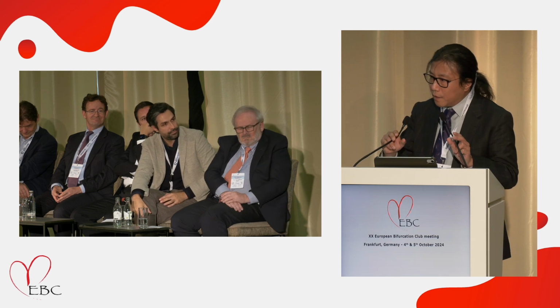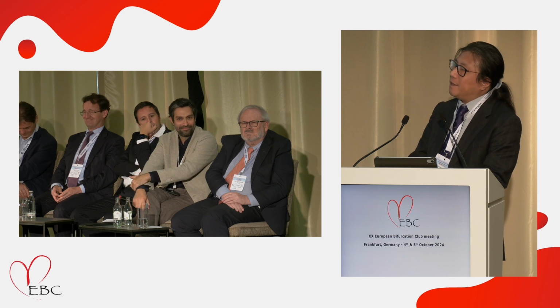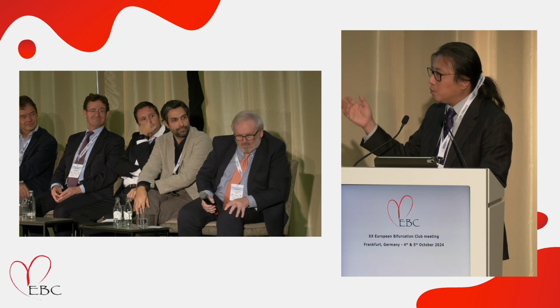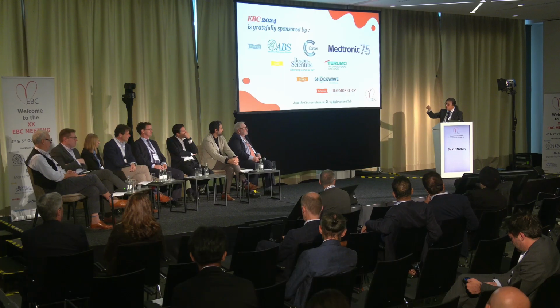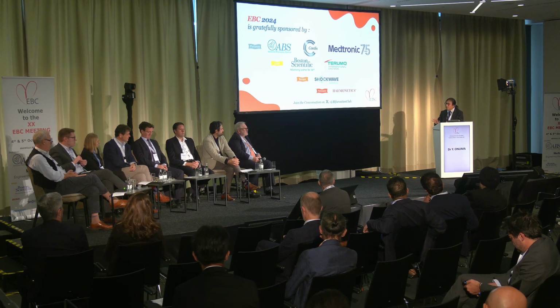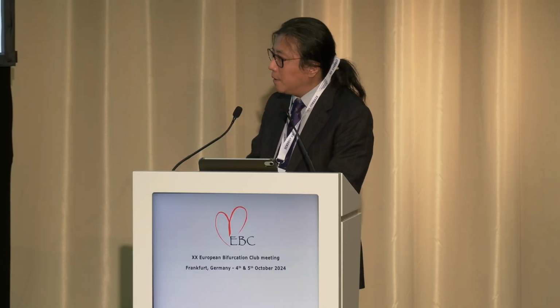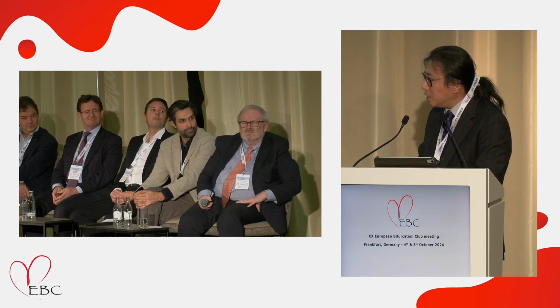Yeah, thank you for your comment, and I agree that we are also a little bit shocked to see this result. But one thing is that this population is very severely diseased, with a SYNTAX score of 44. So it's not about the diagnostic accuracy. Anyway, at the end of the vessel, the FFR-CT is more or less 0.8. So it's not about diagnostic accuracy at the vessel level or the patient level, but I think it has an implication when you use this technology during the procedure, because in the procedure you have to select which bifurcation should be treated and how.